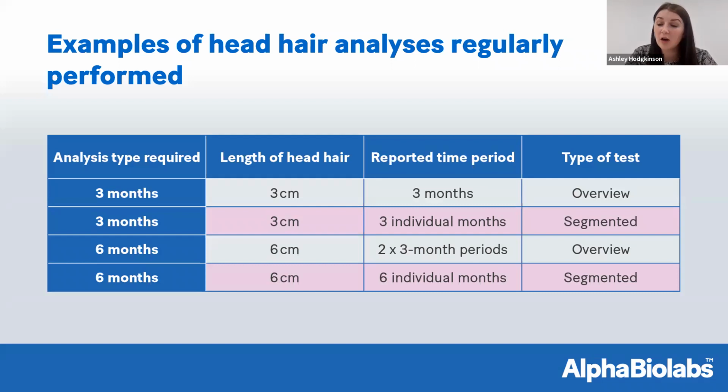Like I've just spoken about, we also are able to offer testing for body hair or nails, but the most preferred method would be head hair because it can be more specific time frame wise. So if head hair is available, we would always advise that you opt for that.